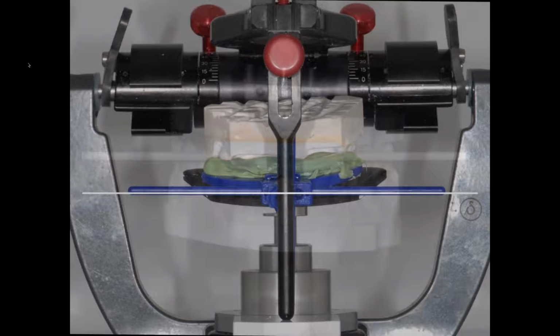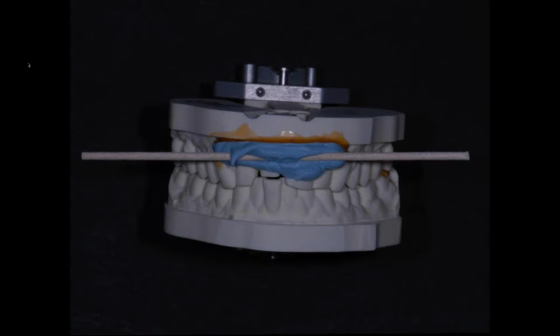And so once we get this stick bite, here's another way to do it. But again, he maybe indexed this a little bit too far apical, but it works. It's away from the incisal edges.